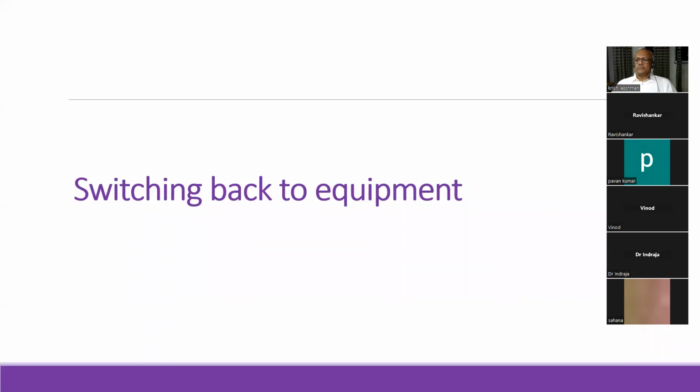So that is one good practice that we all have to probably adopt. And the other thing is, you have to remember that in your quest to achieve hemostasis, you can actually damage the bile duct or other important structures in that area. So whenever you are holding something, you be sure that what you are holding and using the energy sources.